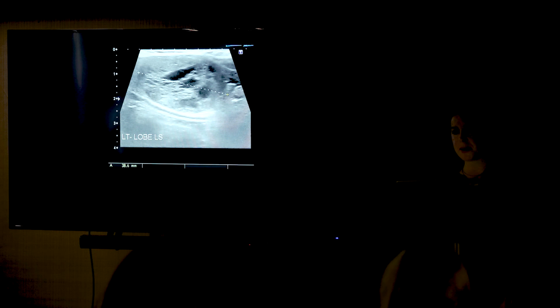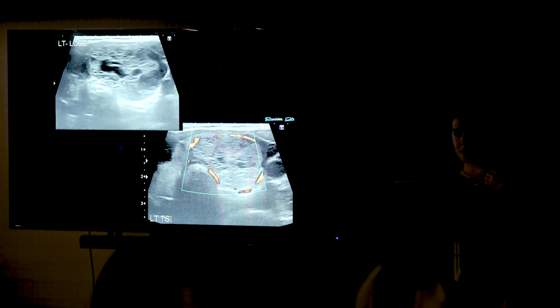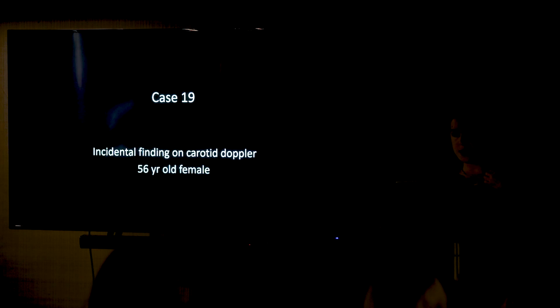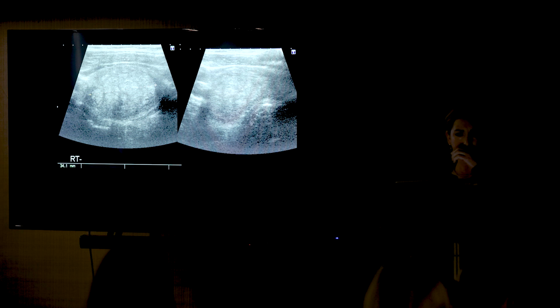Okay, so classic appearance here that Vena showed. So what U grading would you give this nodule? Again, seen a couple of things like that. I'll skip through that one. Okay, this one has a pattern that we've not discussed today, but we'll discuss it with the histology. But what grading would you give that, and what would you put? Would you put a needle in that one?